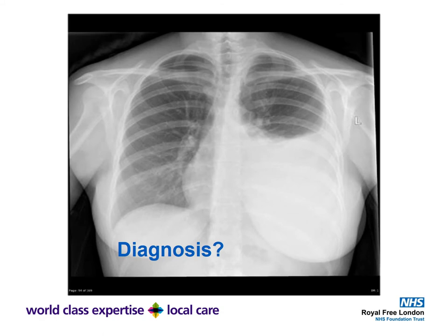What's the diagnosis? Give yourself a few seconds to think about it. This is a left large pleural effusion, as demonstrated by the air-fluid level towards the top of the left lung. This is the type of patient we would investigate with ultrasound and pleural aspiration, and possibly proceed to CT of the thorax.